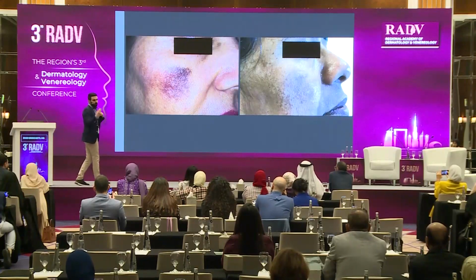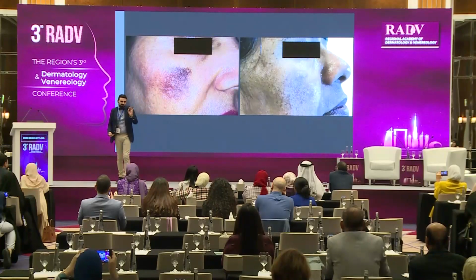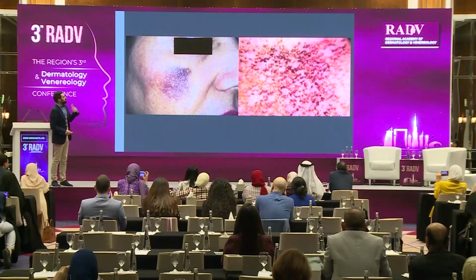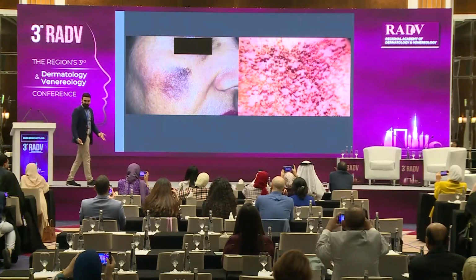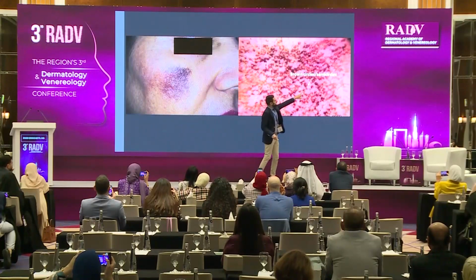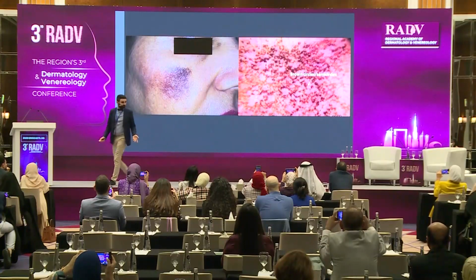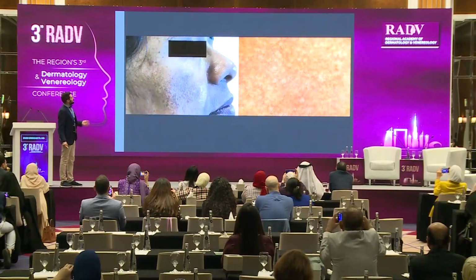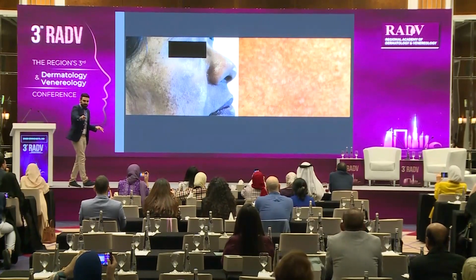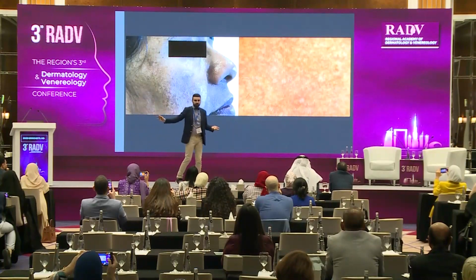Here, I agree with you. This is exogenous ochronosis because we have these tiny brown-black papules. But on dermoscopy, I can have the confirmation because we see these circles, semicircles, so we can confirm our diagnosis. Okay. And then here, do we have dots? No. Do we have circles? Yeah, melasma, because we have a pseudo-network. We have a homogeneous brown pigmentation. Great.